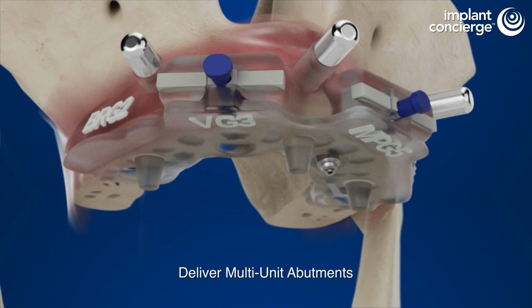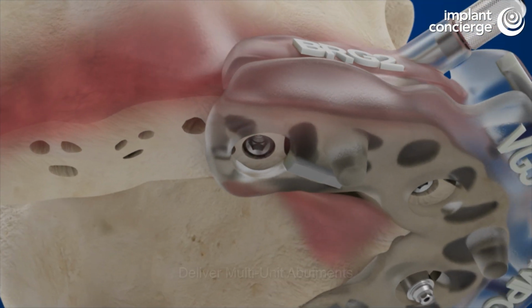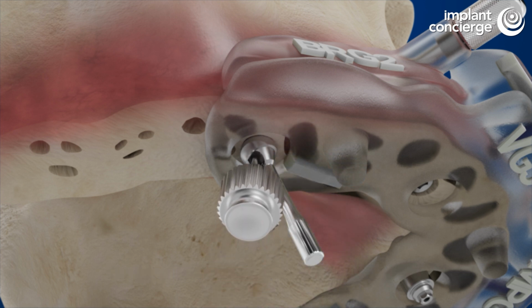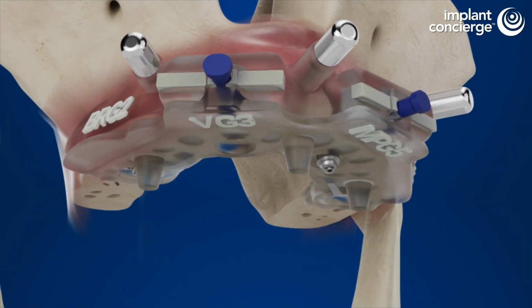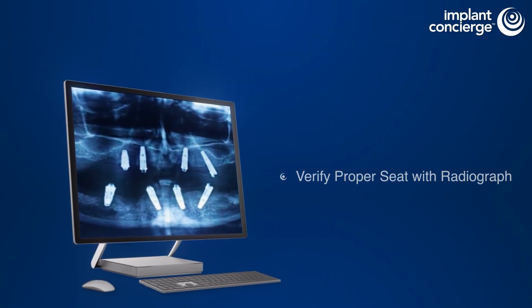Follow the provisional component list to deliver the multi-unit abutments. For angled implants, align the abutment hex driver to the indicator line on the multi-purpose guide for angle correction. Tighten according to the manufacturer's torque recommendations. Take a radiograph to confirm the proper seat of the multi-unit abutments.